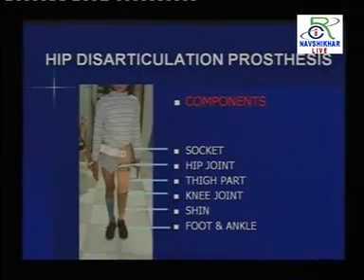सॉकेट में ज़्यादा डिफरेंस नहीं है तो कैन बी कंटिन्यूड विद द सॉकेट इटसेल्फ, बिकॉज साइज़ में जो चेंजेस, अगर ज़्यादा मोटापा नहीं आया, बड़ी नहीं हुई, ग्रो कर रही है, हो सकता है मोटी ना हुई हो, तो उस वजह से देन वी कैन हैव दिस सेम सॉकेट कैन बी यूज्ड. अगर कुछ अल्ट्रेशन या कुछ अमेंडमेंट की ज़रूरत है तो करी जा सकती है, बट होप सो कि शी विल बी कमिंग विद इन अ शॉर्ट पीरियड। बट शी इज़ वॉकिंग वेरी कंफर्टेबली.